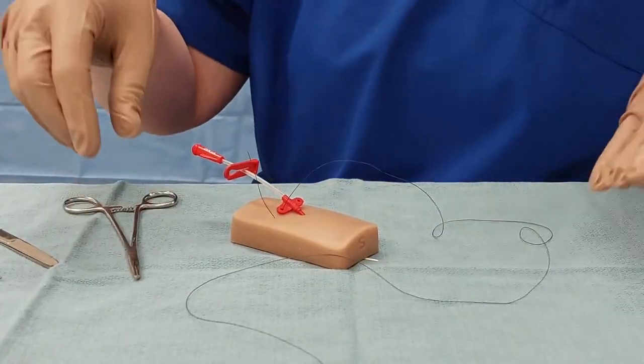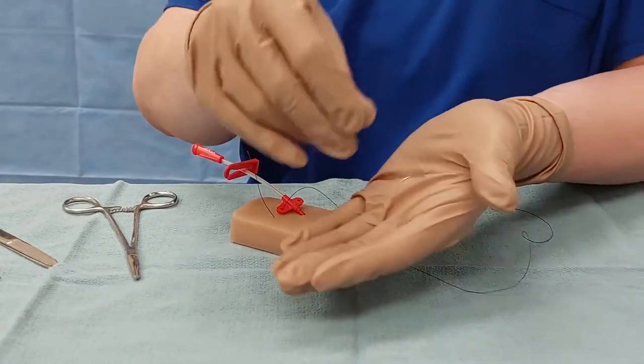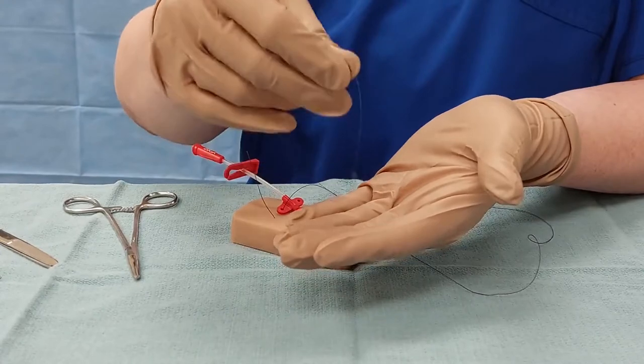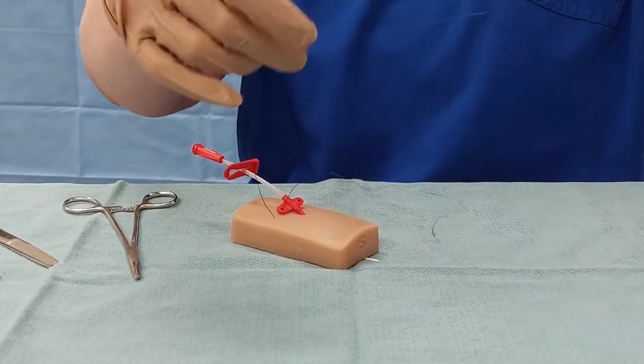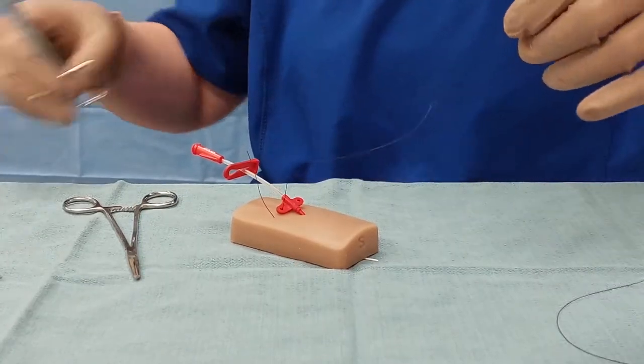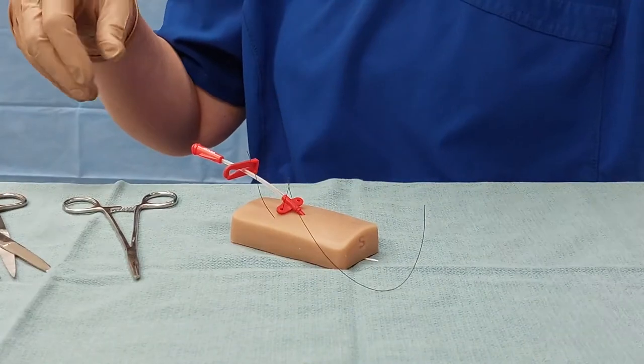Now let's talk a little bit of needle safety. If it's loose, there's no force behind that needle, so it's almost impossible to poke yourself — but you can be even safer than that. Leave yourself a good length of thread, just cut that off, and then your needle is out of the way.